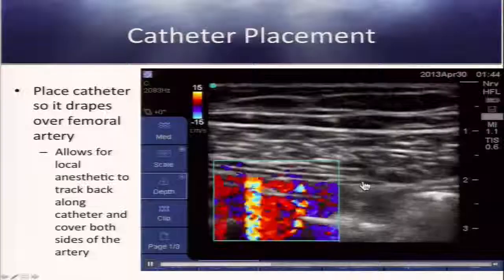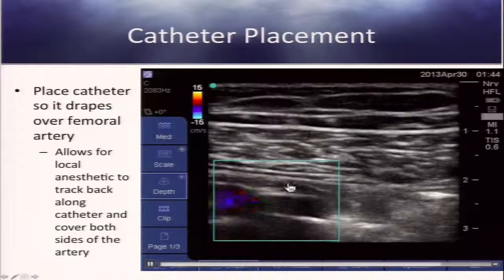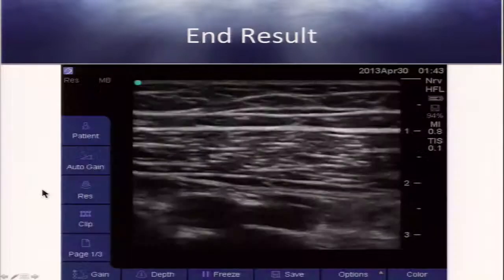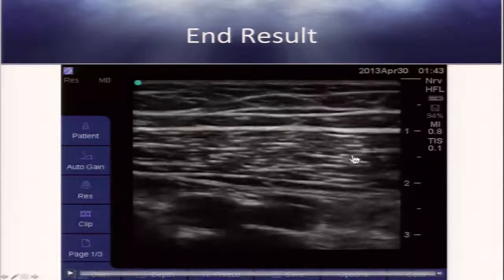If you look at this, you can see that is both the artery, and then the full color is when I injected fluid through the catheter. However, it's fairly imprecise to use color to find exactly where your catheter is. So another way of doing it, and what I prefer, is to actually use air.